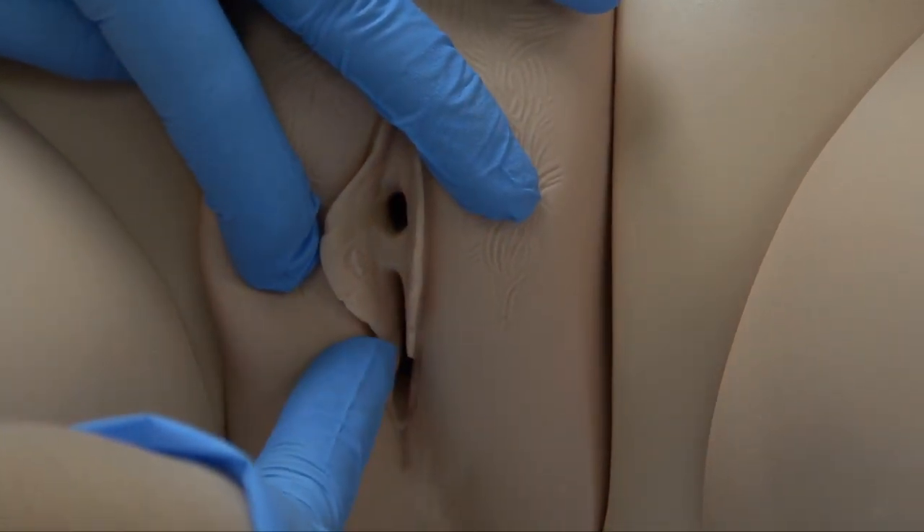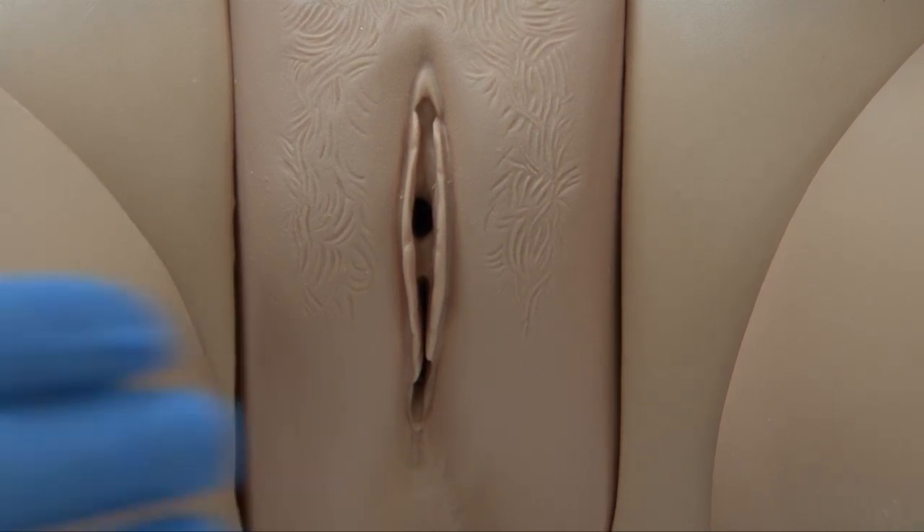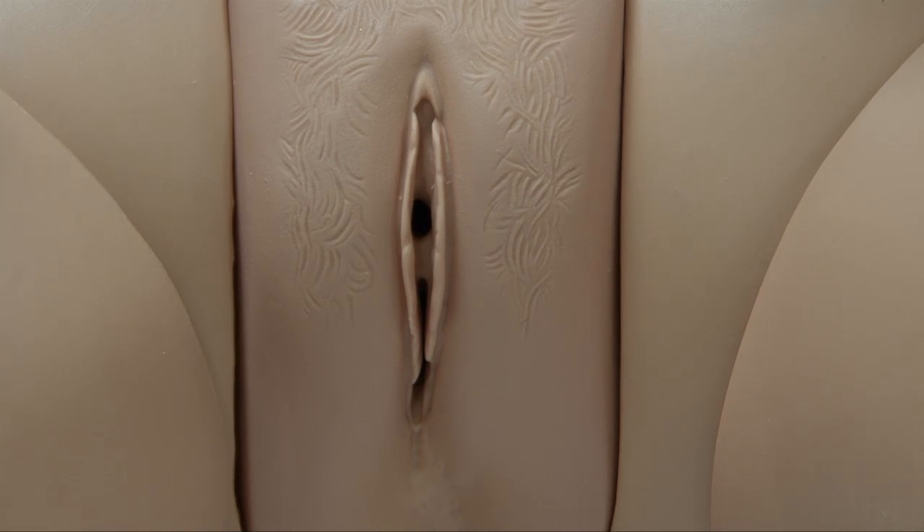Very commonly, when catheterizing ladies, folks will inadvertently insert the catheter into the vagina. If you do that, leave that catheter in there so that when you get your next kit you'll know where not to go — but make sure you explain to the patient why you're leaving it there. I can actually see her urethra quite well. This is one of the reasons you want to examine your patient during perineal care beforehand, because sometimes you can't see the urethra very well — it may have withdrawn up inside the vagina.